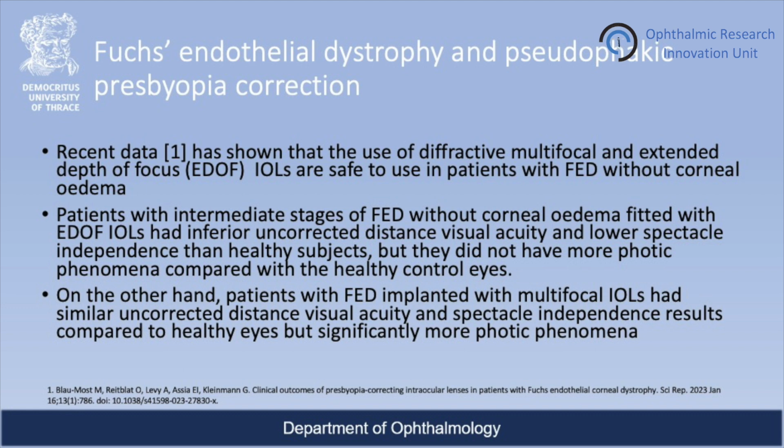On the other hand, patients with Fuchs' endothelial dystrophy implanted with multifocal intraocular lenses had similar uncorrected distance visual acuity and spectacle independence results compared to healthy eyes, but significantly more photic phenomena.